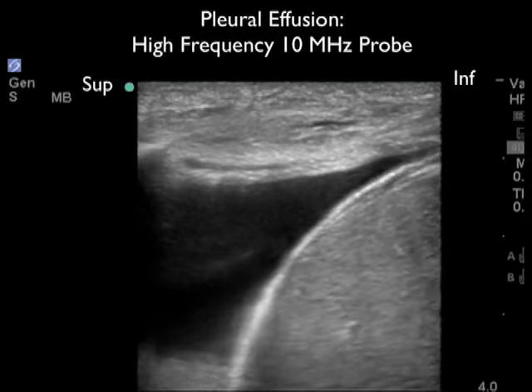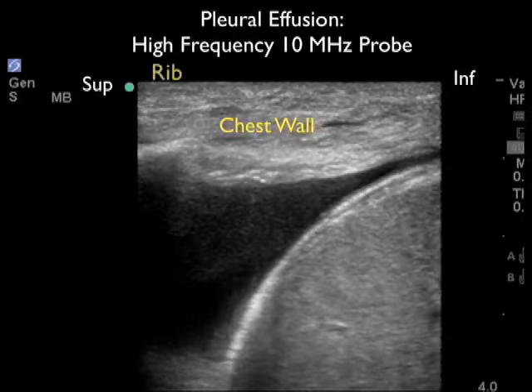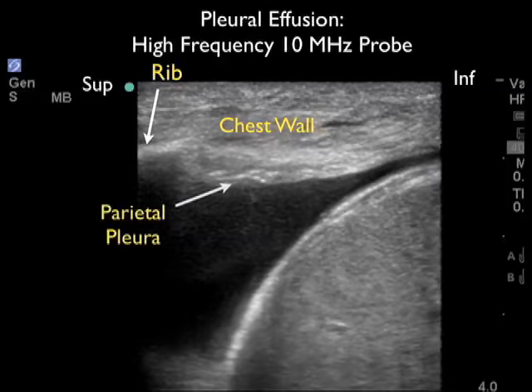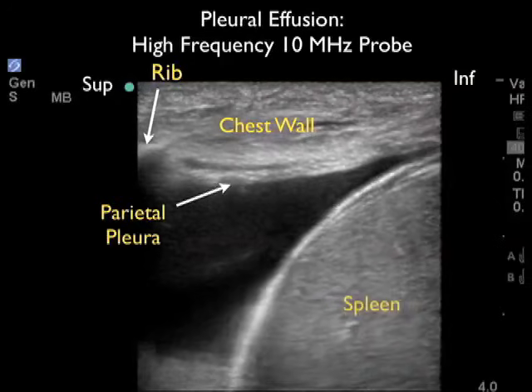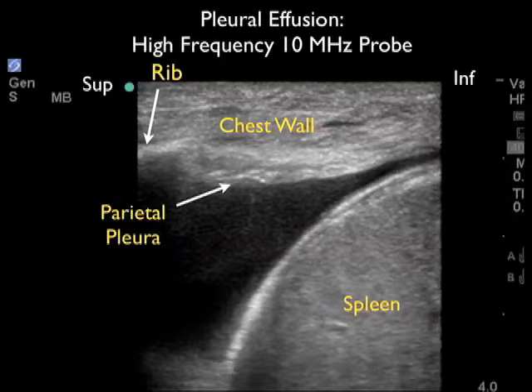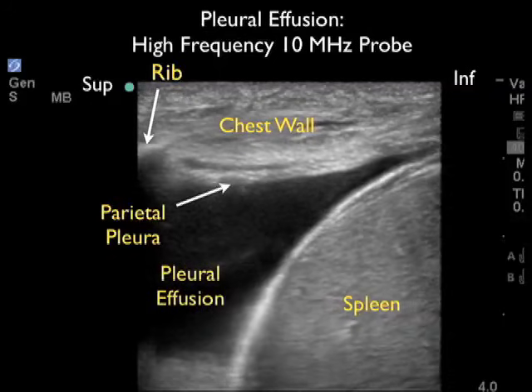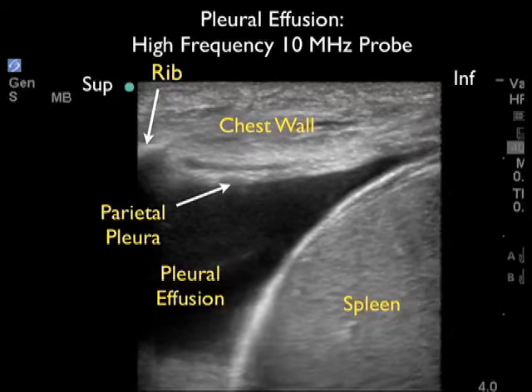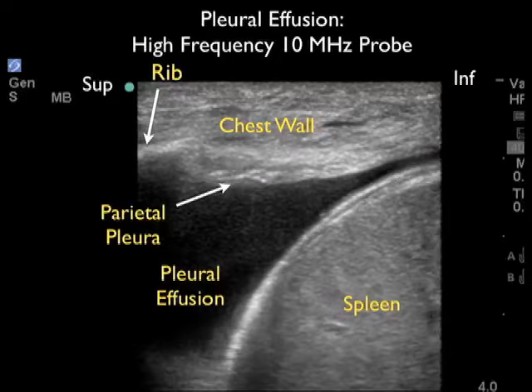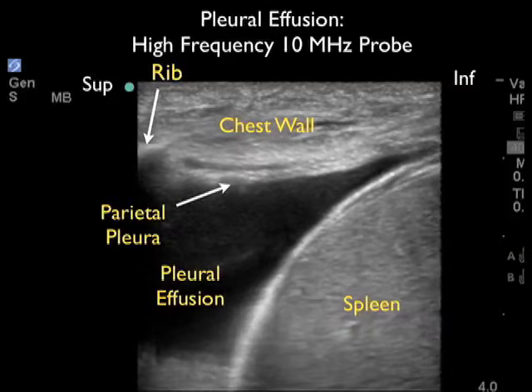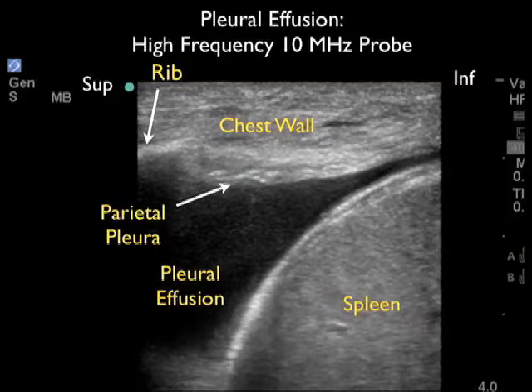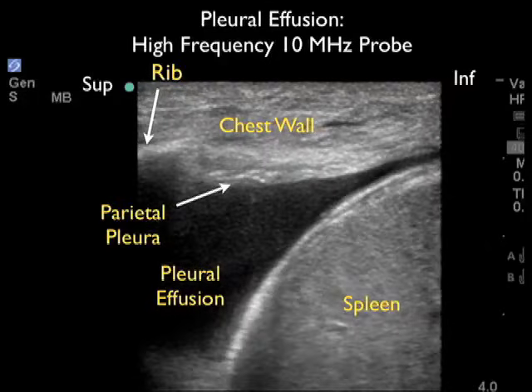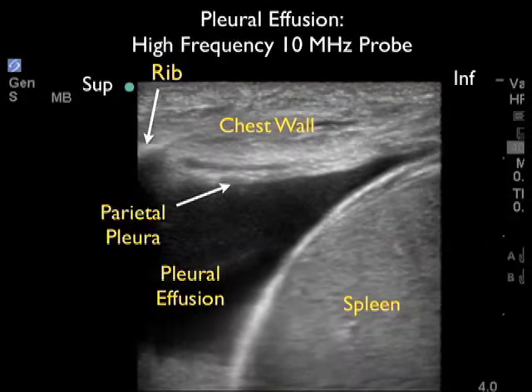In this ultrasound image again taken with a 10 megahertz high frequency probe, we can see the diaphragm moving back and forth as the patient breathes, defining the lower aspect of the thoracic cavity. It would therefore be unsafe to perform a thoracentesis at this level of the chest wall because we might go through the diaphragm and into the spleen with the needle. So it's important to look first to ascertain the level of the diaphragm and make sure that the thoracentesis needle is going safely above the diaphragm so as not to puncture into the abdominal compartment.